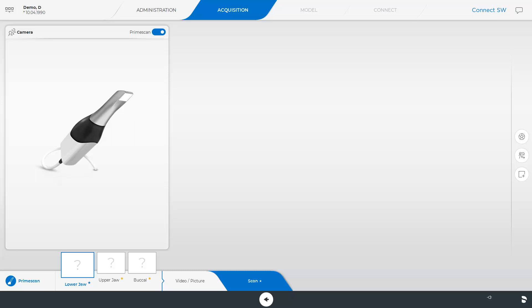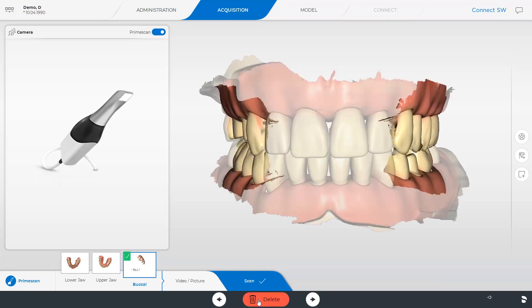Next, you will see the final 3D models scanned with the prime scan. As we have defined restorations in the upper as well as in the lower jaw, we have performed two full jaw scans and, in the case of the buccal image catalog, a bilateral scan was performed.